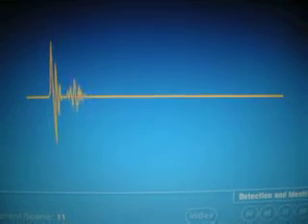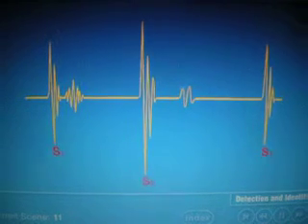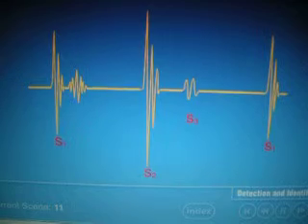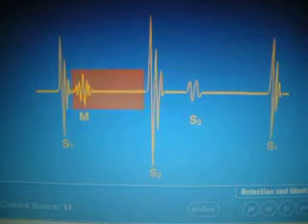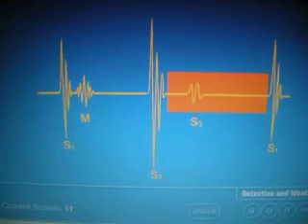Detection of murmurs begins by first detecting all cardiac sounds, beginning with S1 and S2. All other heart sounds are then identified. What remains is most likely to be a murmur. One must listen selectively for an extended time to the periods of systole and then of diastole to be sure nothing is overlooked.